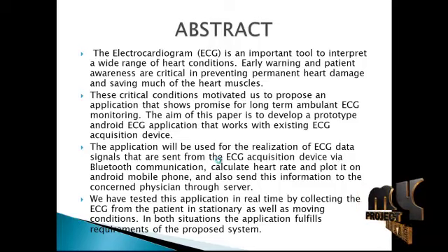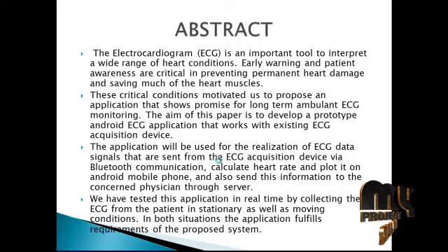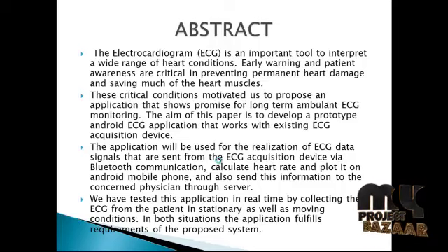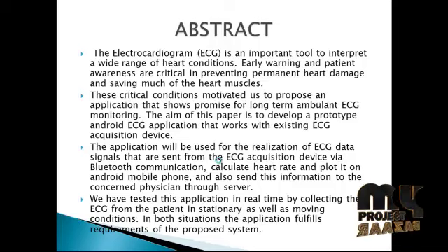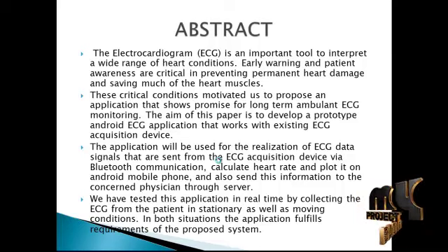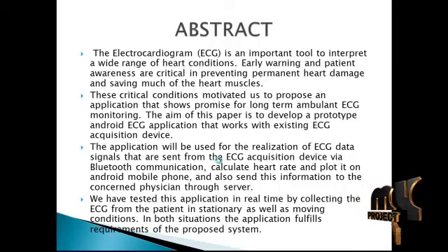The Bluetooth module is a short-range communication system intended for cable replacement between electronic devices. It is low-cost and low-power. A Bluetooth system consists of the RF transceiver, baseband, and protocols or software services. First, in the initialization of communication with the ECG system, this module is involved with the settings of the communication with the ECG device using the Android Bluetooth API. Identify the mutual recognition between the device and the receiver, sending acknowledgement to the hardware.